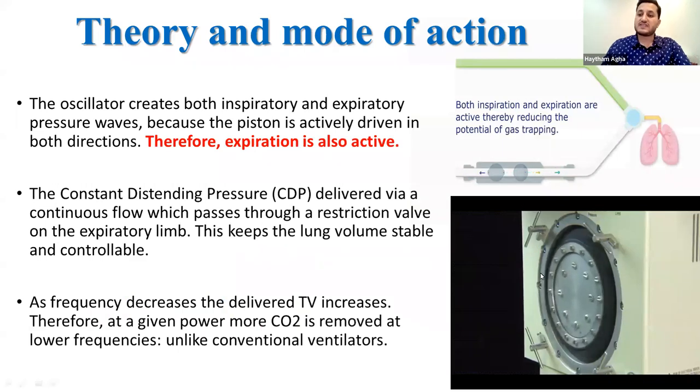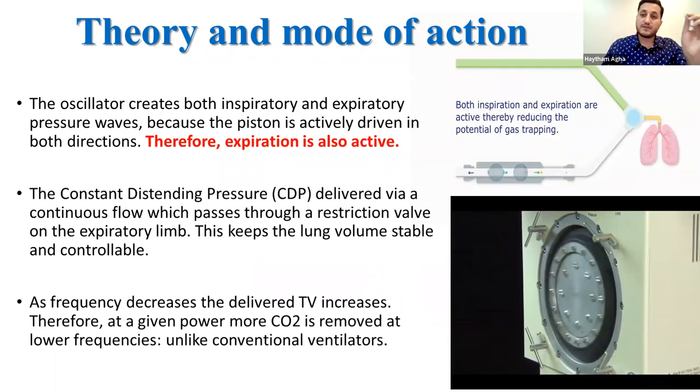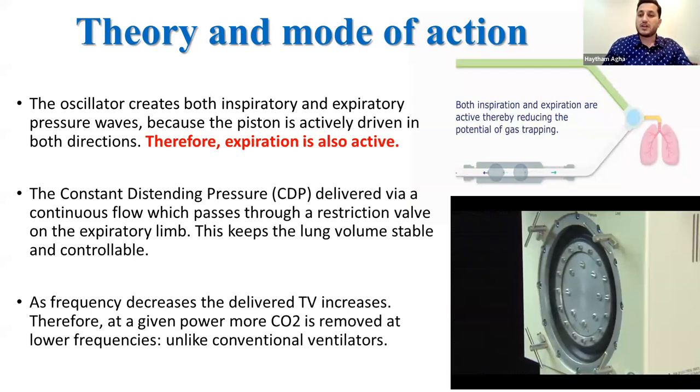Now let's see the dynamics of the machine and the mechanics of the lung. This is called the piston. This piston is the most important part of the high frequency ventilator. It acts as a diaphragm moving in and out during inspiration and expiration. So here the expiration is active, and this is the only active expiration that can be found in all modes of mechanical ventilation. And this has a very beneficial use in that it prevents further air leak or further overinflation of the lung.